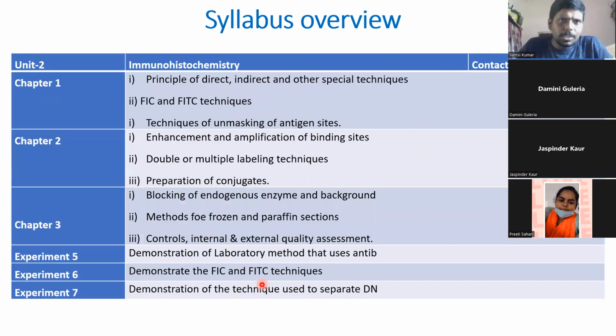Then let us go to unit 2. In unit 2, they go with the actual antibody detections. Here we are using fluorescein antibodies, fluorescein immunoassays. So we take a primary antibody and a secondary antibody, and this secondary antibody will be conjugated with a substance that will glow under UV light. So we will use a modified microscope and modified antibodies for detection of specific antigens in the tissue.